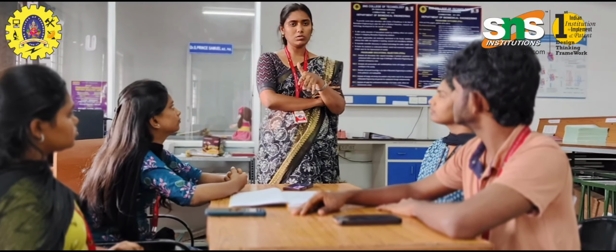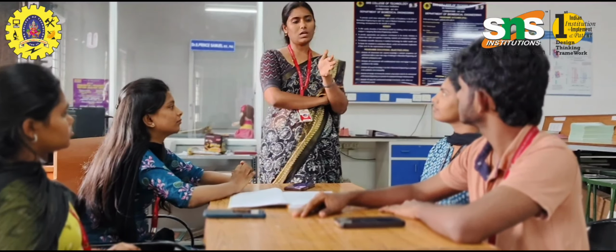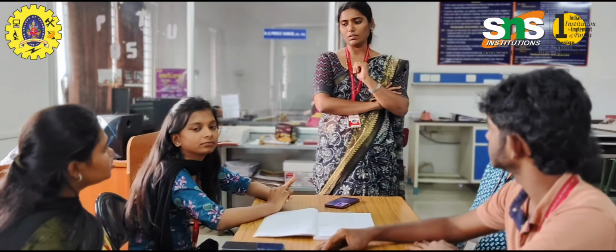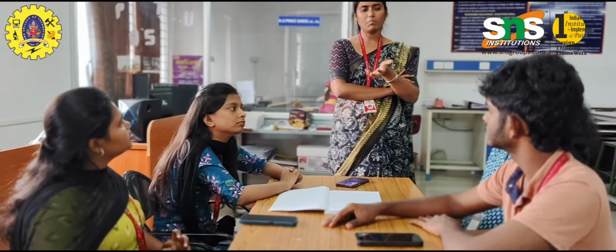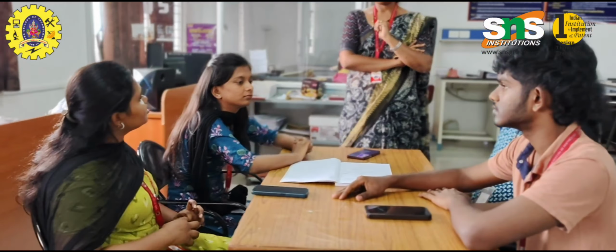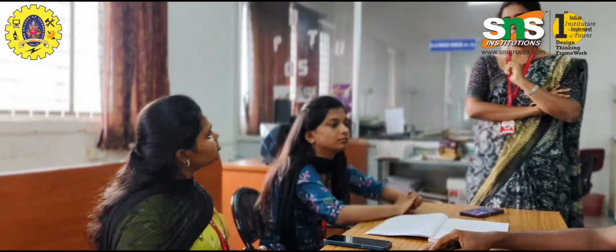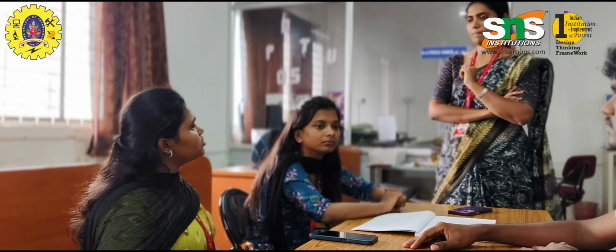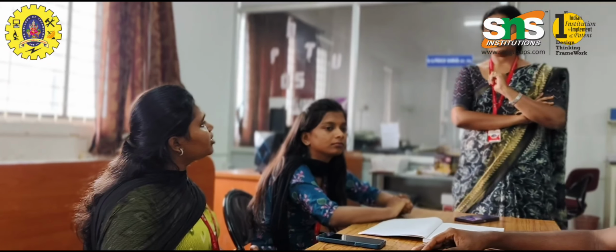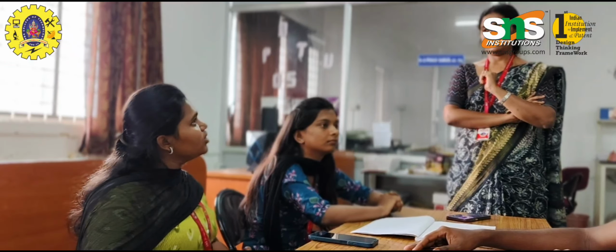Yes, then we will conclude this group discussion with the applications. So can anyone say what the applications of this ESU are, like where it can be used? Yeah, there are so many applications. Generally, we use it in surgeries. When we do open surgery, we take the help of electrosurgical units for cutting tissues and coagulating.